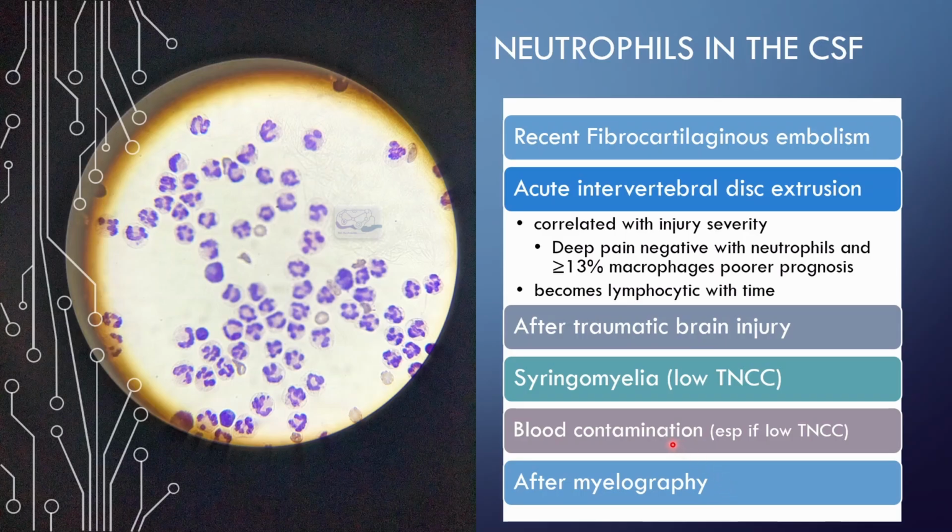Because if you take the sample after myelography, you're going to see an inflammatory tap, and so it makes it very difficult to interpret. So it is better to send this sample off, even if it's not useful, than it is to miss taking the opportunity to analyse it and then to have to re-anaesthetise the dog and get a sample again.